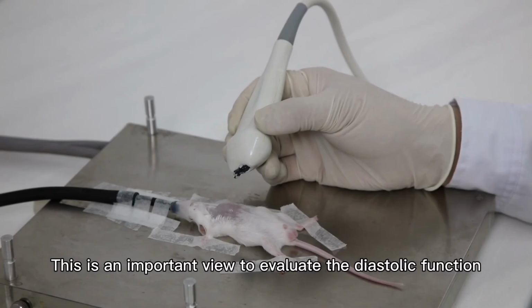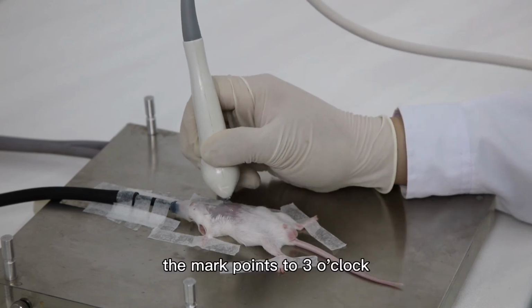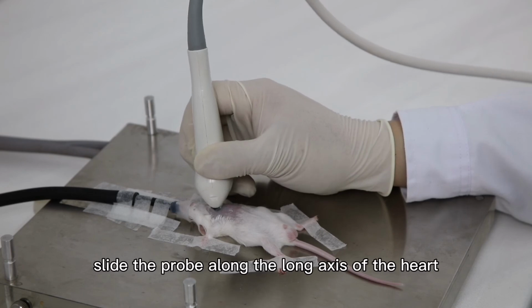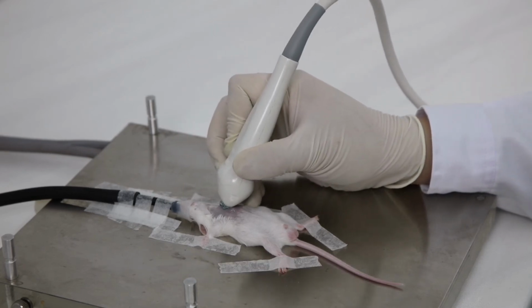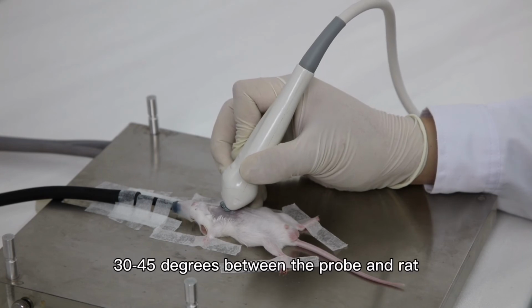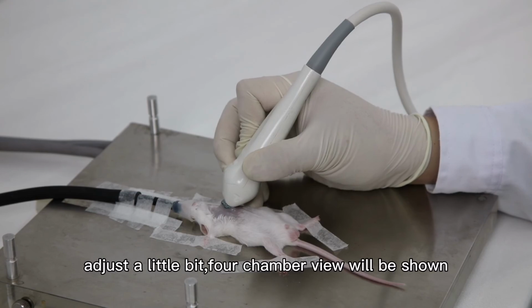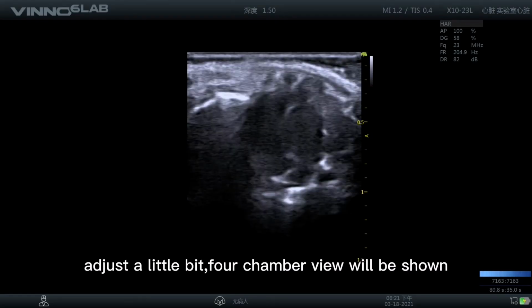4-chamber view. This is an important view to evaluate the diastolic function. Based on the short axis view, the mark points to 3 o'clock. Slide the probe along the long axis of the heart, 30 to 45 degrees between the probe and rat. Adjust a little bit. 4-chamber view will be shown.